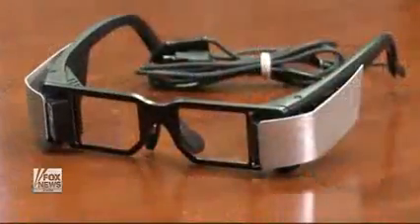It's light. Dr. Samuel Achilefu, a professor of radiology at Washington University, invented the cancer goggles. This is the new see-through goggle device. They are much smaller and lighter now than the heavy, clunky design originally created. It should be simple. It should be easy. It should have low learning curve such that we do not need to retrain the surgeons on what they already know how to do.